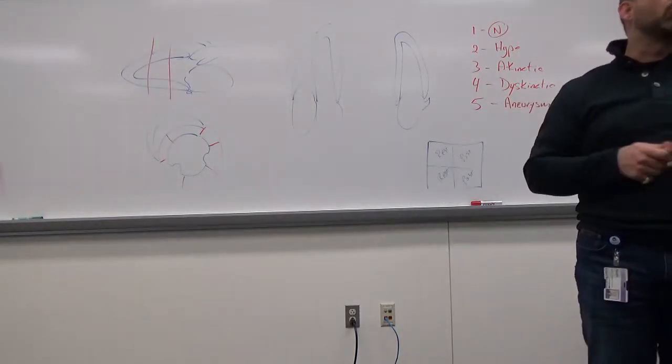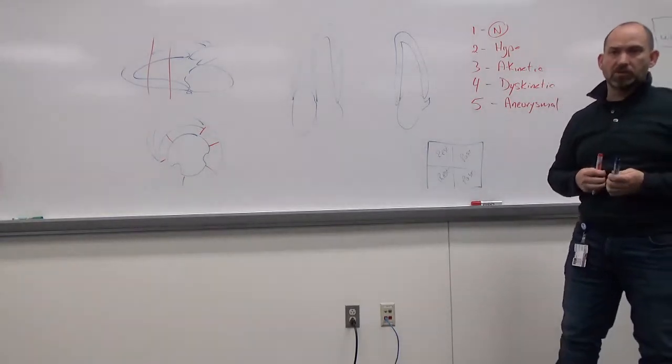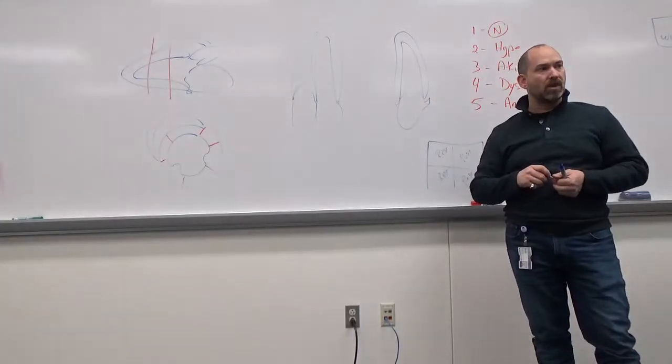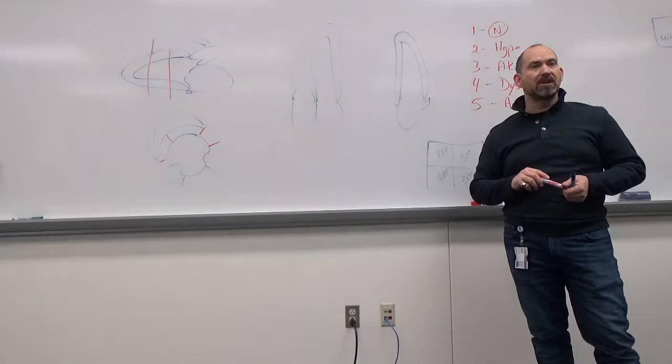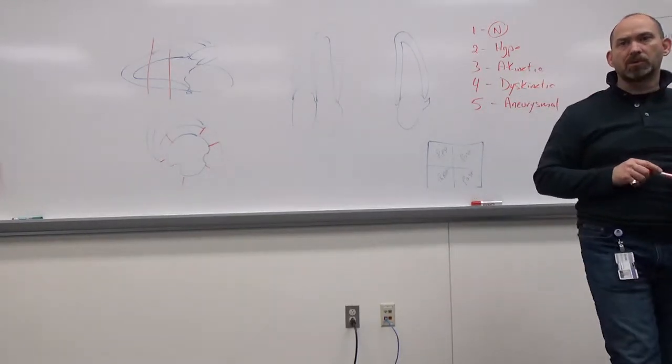So usually 2 to 3 days before the exam, the doctor will have them hold their medications so that they don't do that. But if the patient absolutely has to be on it, we just have to modify our expectations of what's going to happen. We may not be able to get them past the target heart rate. Okay? What is the target heart rate?